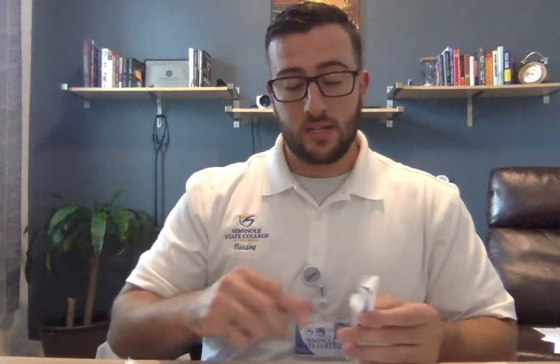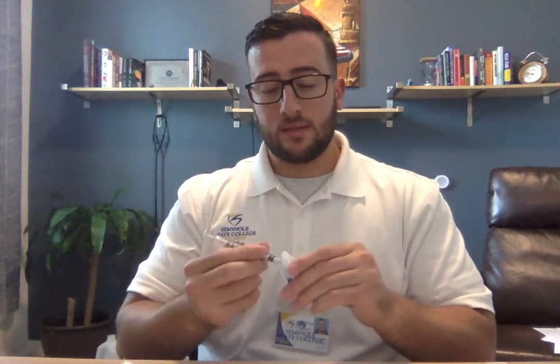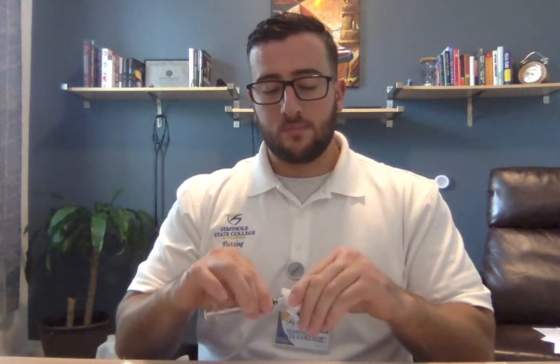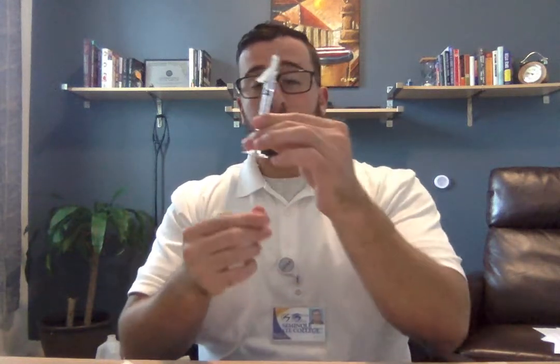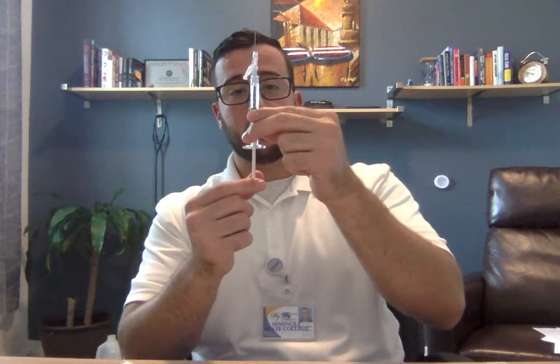Next thing I want to do is go ahead and grab my syringe and my 1 ml syringe and my 23 gauge needle. I'm going to go ahead and take out my syringe. Make sure not to contaminate the inside of the plunger. And I want to go ahead and get my needle. I'm going to go ahead and put it on. Okay. For that, I am going to go ahead and take it out using the rainbow method. I want to go ahead and bring it down, being sure not to contaminate the inside of the plunger.